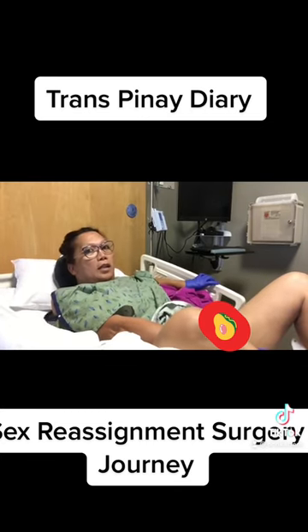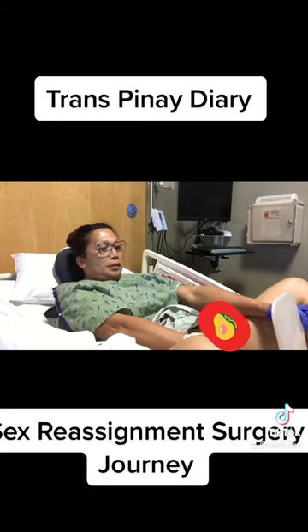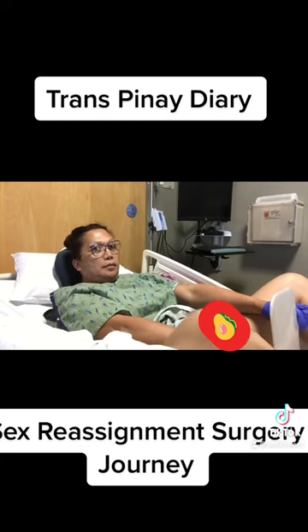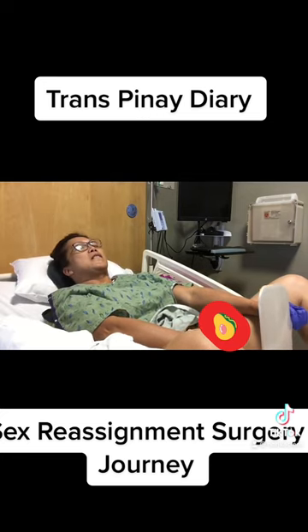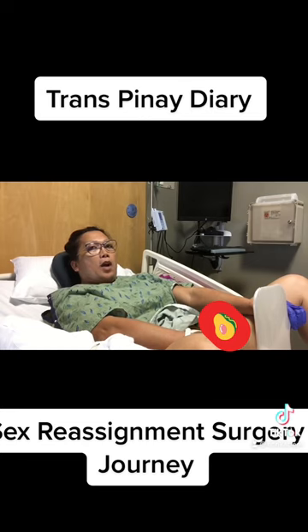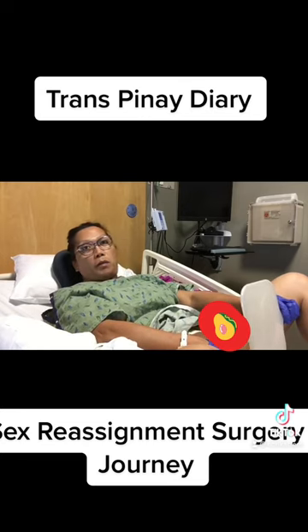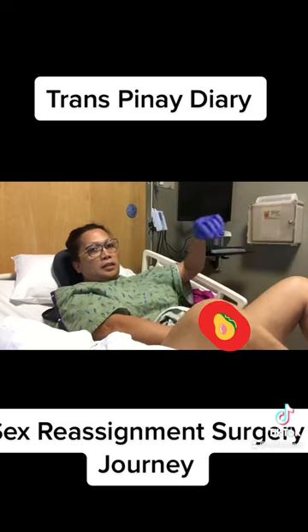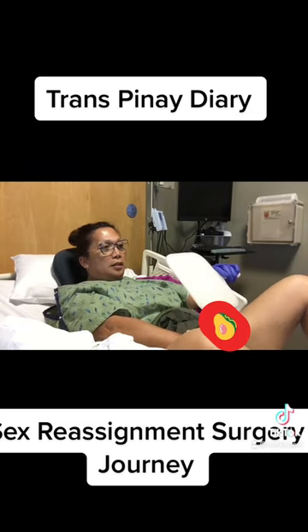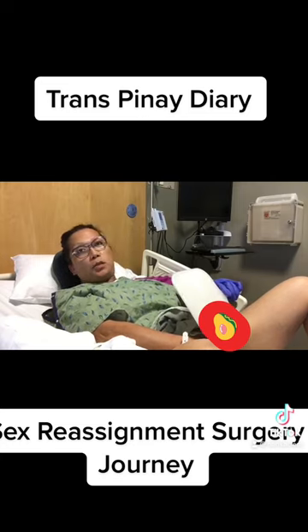I have to adjust my head. It's painful. Now I have reached it and I have to wait for 15 minutes. I have to wait for 15 minutes, okay — until you reach the wall of your vagina.